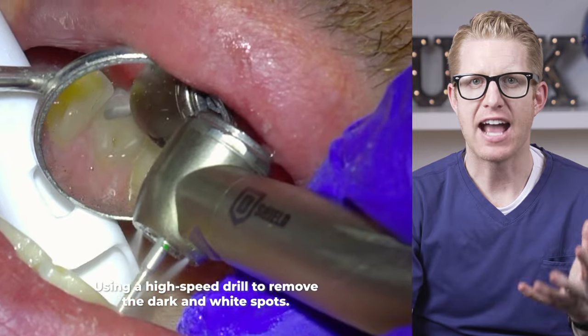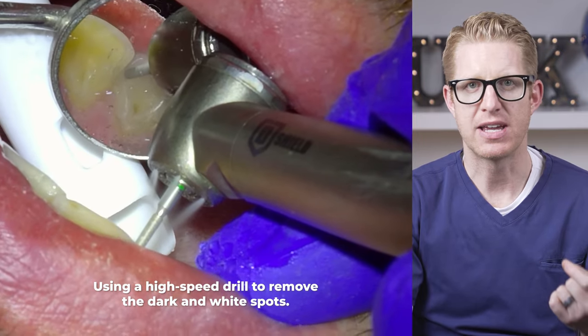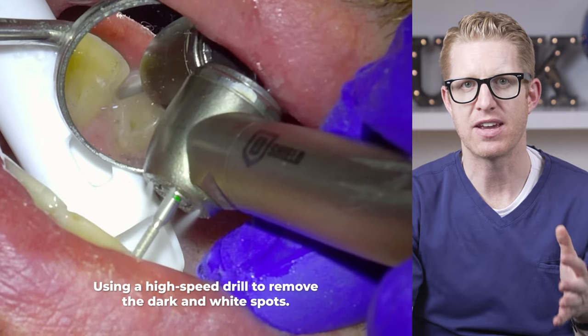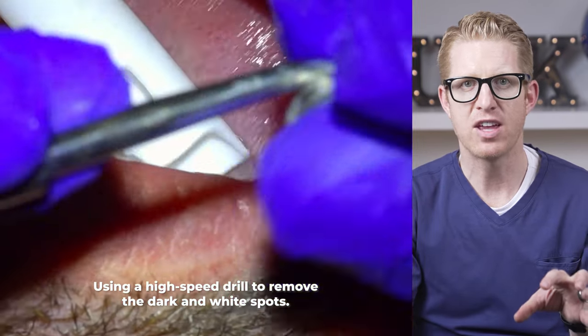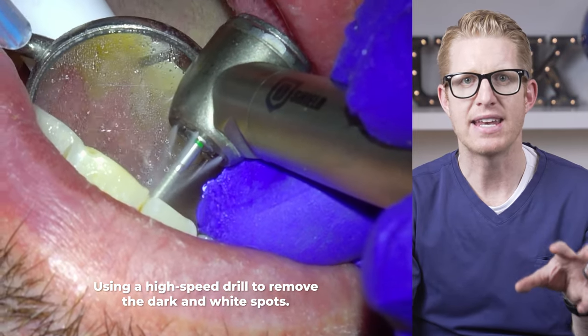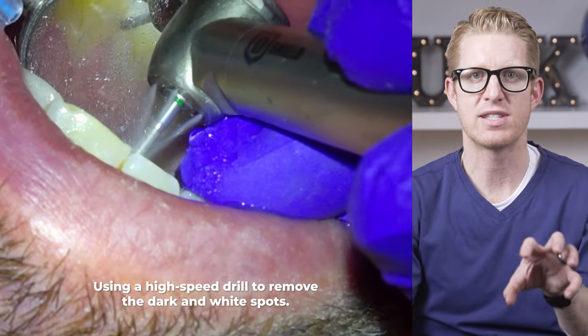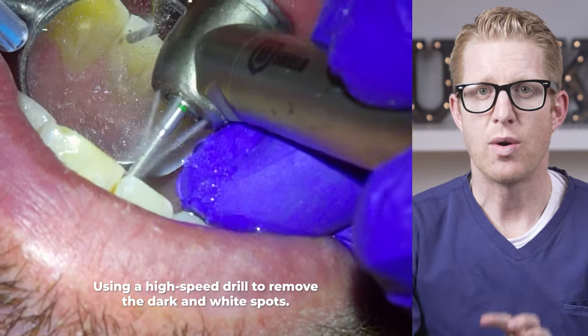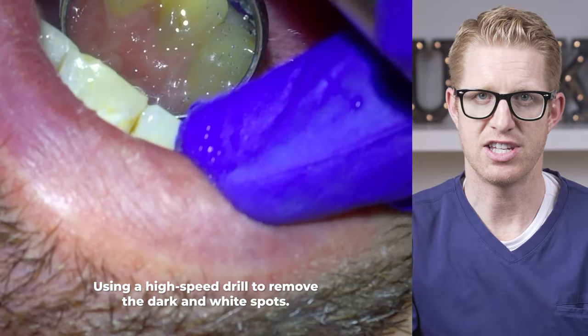While the white spots aren't actually active decay, I still remove all of it. Because if I did a white cosmetic filling only where the dark spots are, the filling would be so obvious and stand out — it would be right next to and right in the middle of the white spots, standing out by contrast. So instead I remove all the white stuff so the filling doesn't stand out.